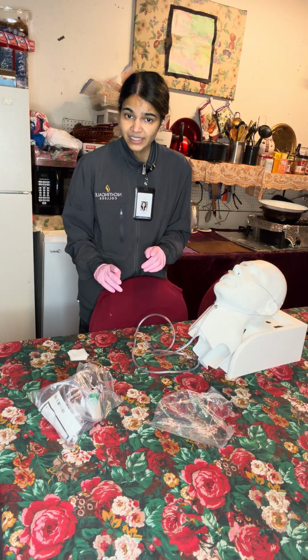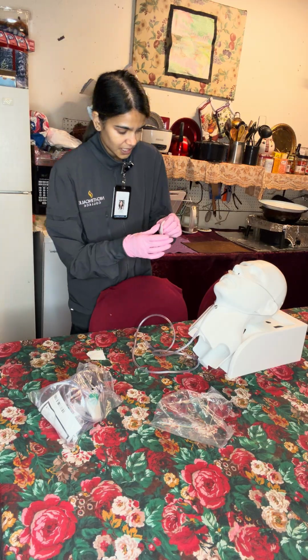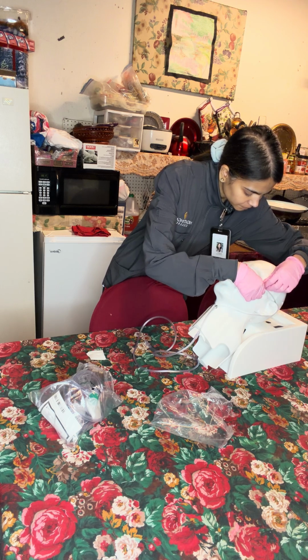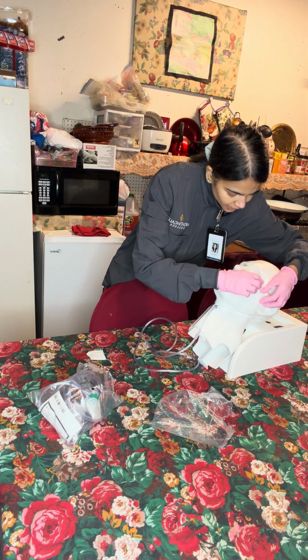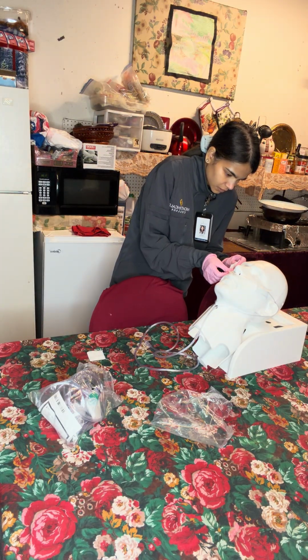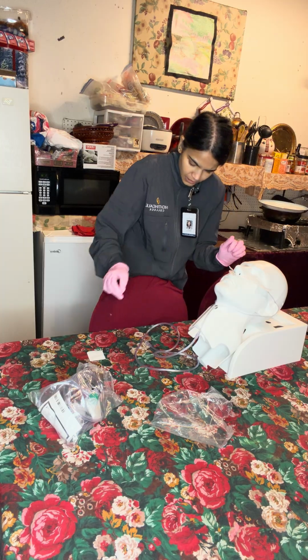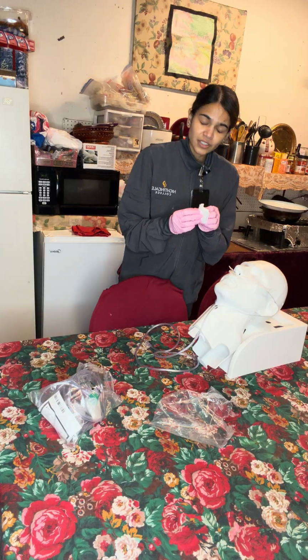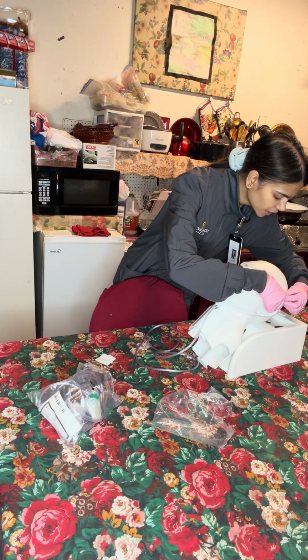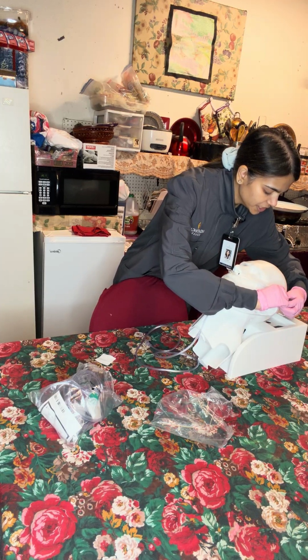To help prevent these, I can apply gauze to the affected areas, such as the sides of the cheek, as well as near the ears, as those are areas that can get irritated quickly as patients use these for longer periods of time.